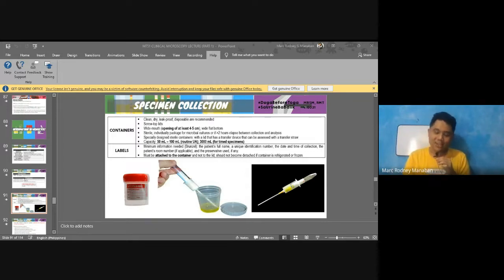Okay, daghan kayong cases, dear, promise, I'm telling you, maka-experience mo na sa hospital assignment ninyo. Alright? So be careful po. I emphasize, dears, na ibang hospitals na interns ma-assign sa receiving section. Mag-example ako sa Soto, no? Ang Soto laboratory, 3 floors na siya. Ang first floor dito ang receiving area.